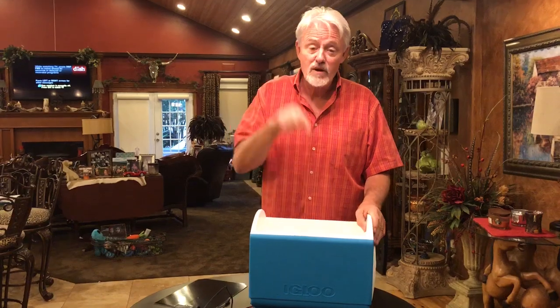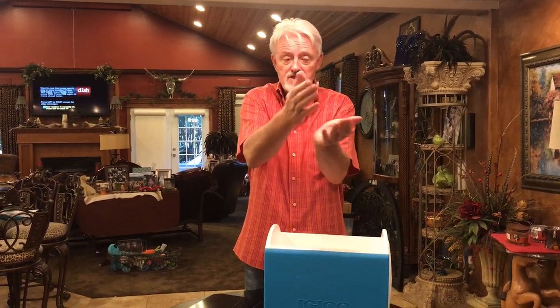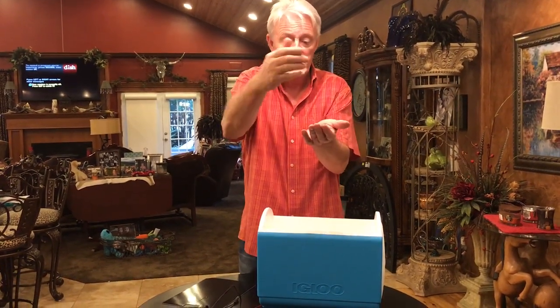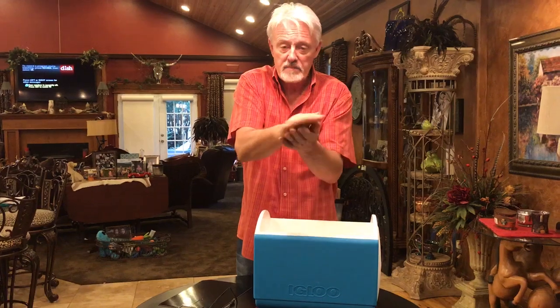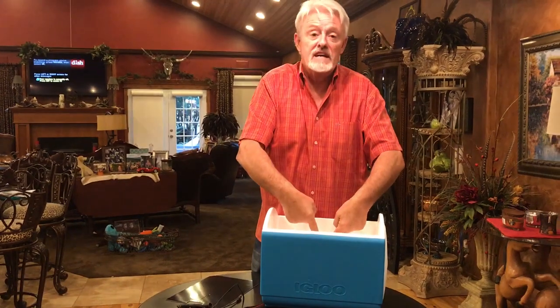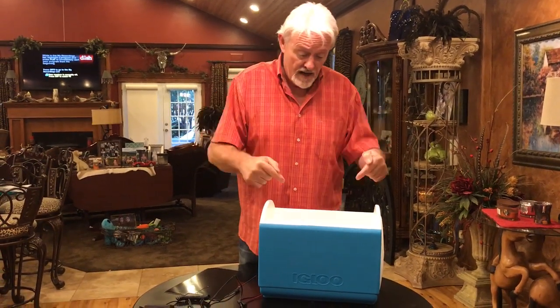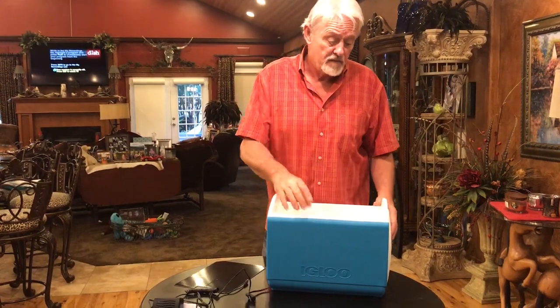And we know where this has been. So what we like to do is, I always clean it before I go. We take a puppy in our hands. Bleach cleaner. Shake it down. It's probably still got a forceps on it. It's been disconnected from mum. It's in our hand. We're rubbing it down, making sure the fluid's good, checking its palate. Make sure it's screaming. And it's screaming, and the next thing it goes in here. It doesn't touch any, I mean, we're paranoid. Look, vets are great, but the thing is that sick animals go to the vets, and sick animals are in the surgery room, and we just want to take every precaution we can to give our puppies the best start. And part of that process is to have them nice and secured in there.